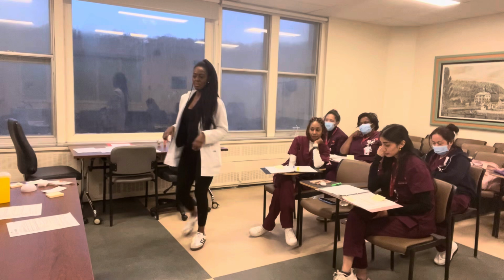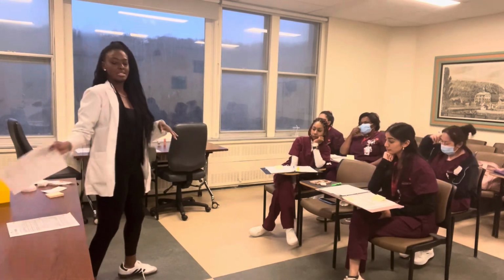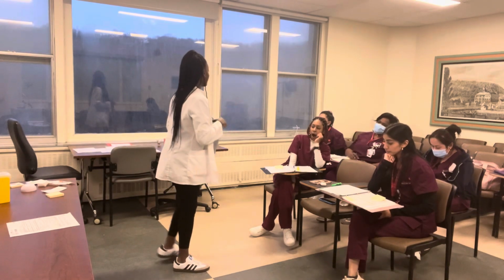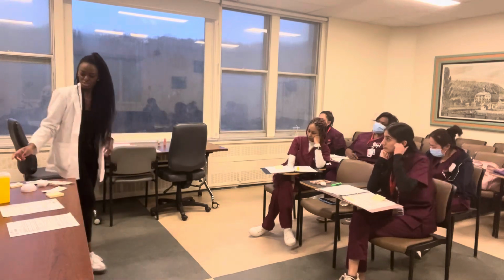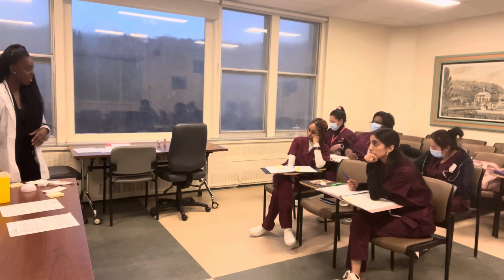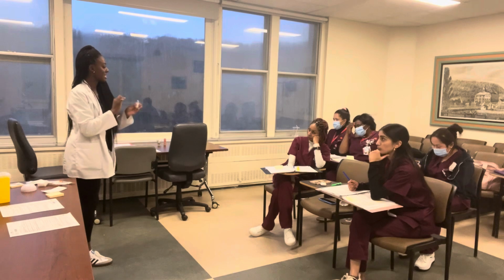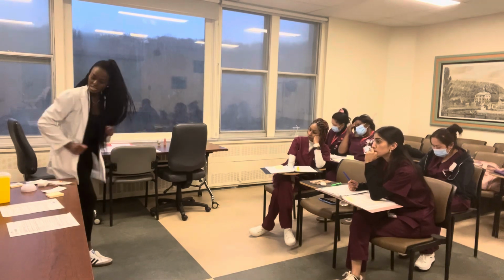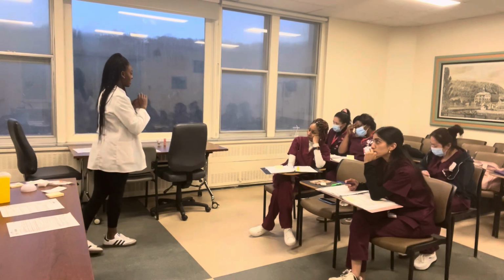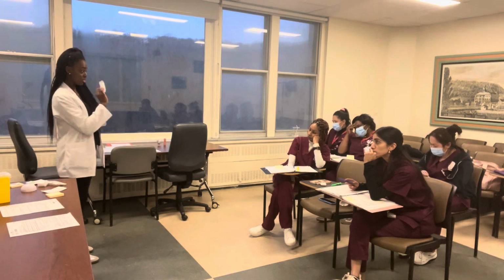The only other thing I'm going to remind you, now I see that many of you are on the right track, which is great. So you want to continue. I'll just mention one other thing. When you write the amount of insulin, that's the time when you're going to start to prepare it. So you're going to create your label, and then actually draw it up out of the right vial. You have to pick the right one that says either Lantus for one, and the other one would be Humalog. Pick the right insulin, do the right checks, and then draw it up with the right syringe, okay?